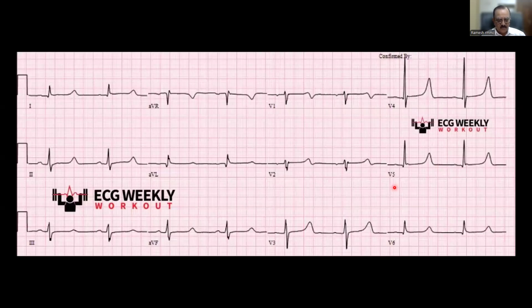Right. What is this? Bradycardia. Prolonged QT. Excellent. See this QT. Prolonged QT, long QT syndrome? Yes, very good. Most probably it is due to the bradycardia. That is why you have to apply the QTc here. You have to look for the QTc. It looks so abnormal, but if you calculate the QTc, it may be normal also. For this rate, this QT may be acceptable.